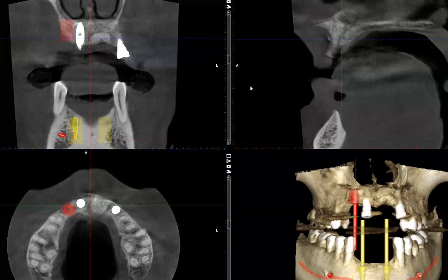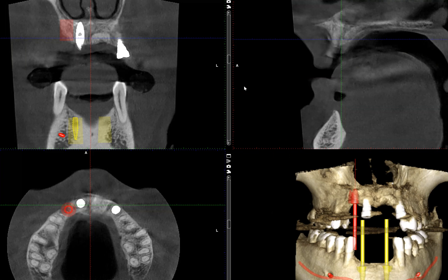Hello, everyone. Today, I want to show you a case where dental implants in the anterior maxilla has penetrated the floor of the nasal cavity and went into the nasal cavity.